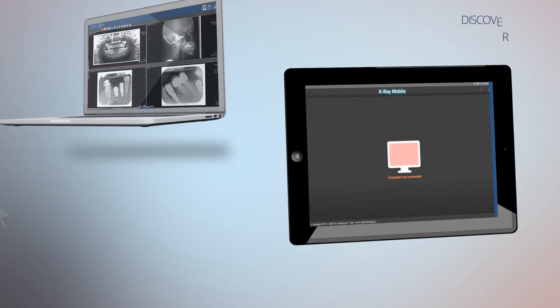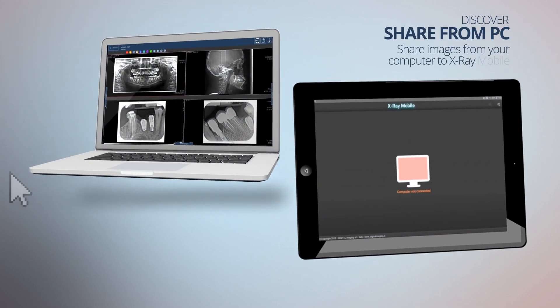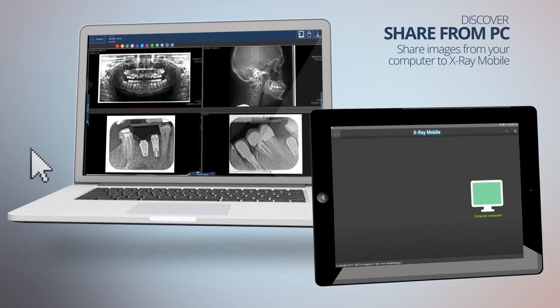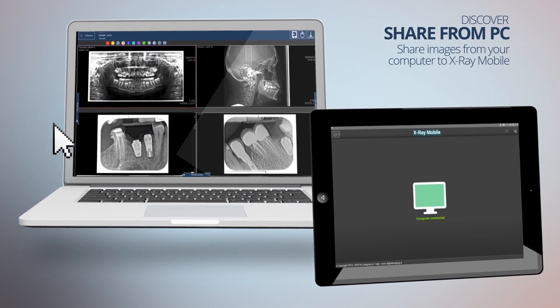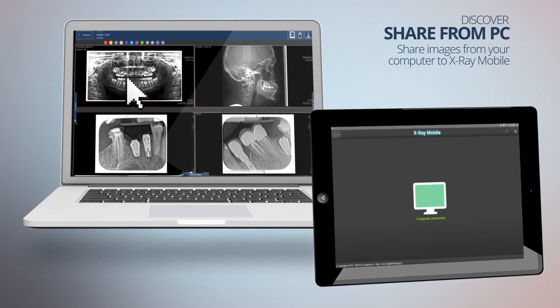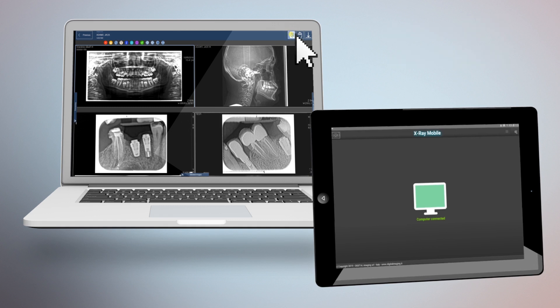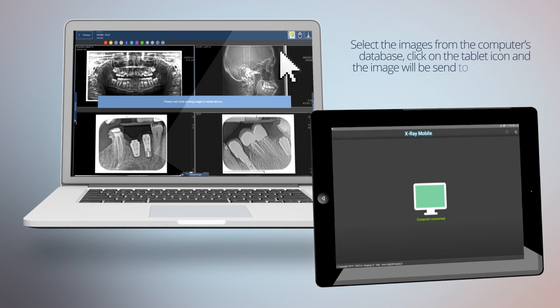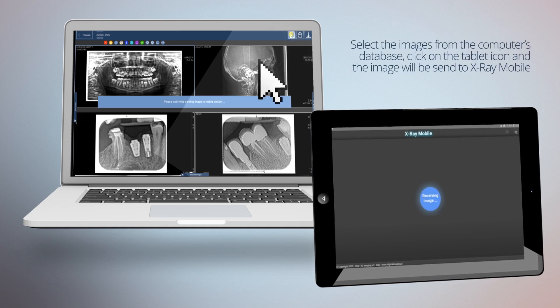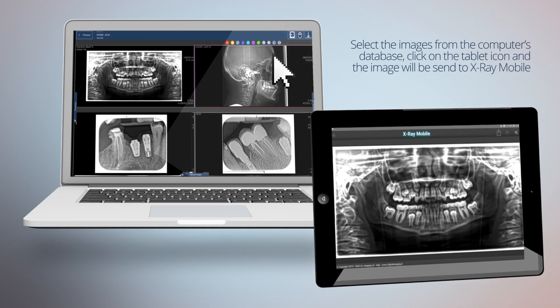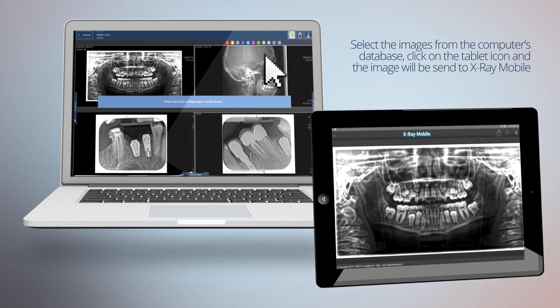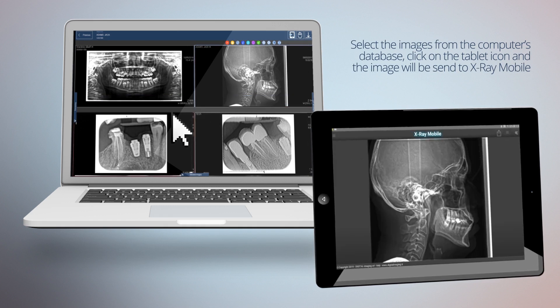Share images from your computer to X-Ray Mobile. Select the images from the computer's database, click on the tablet icon, and the image will be sent to X-Ray Mobile.